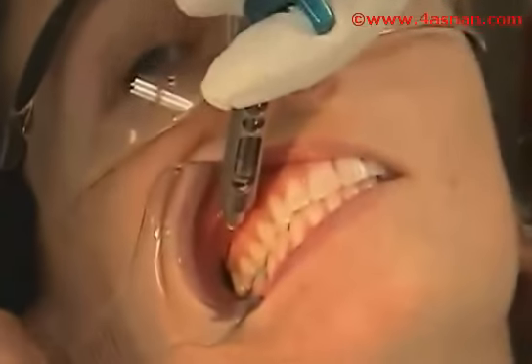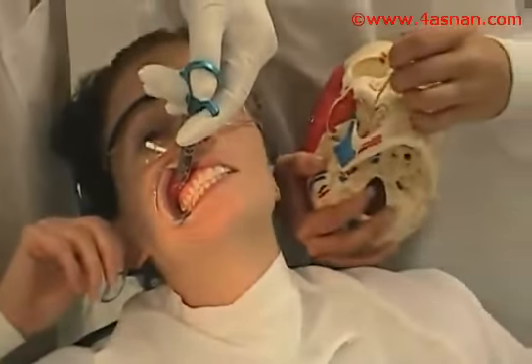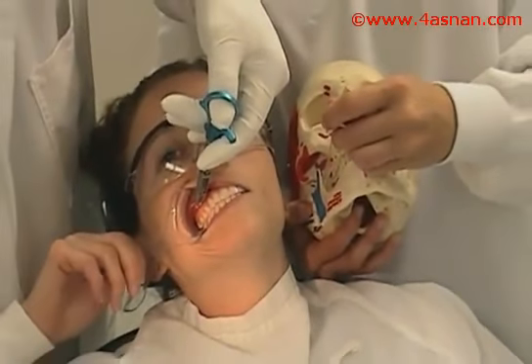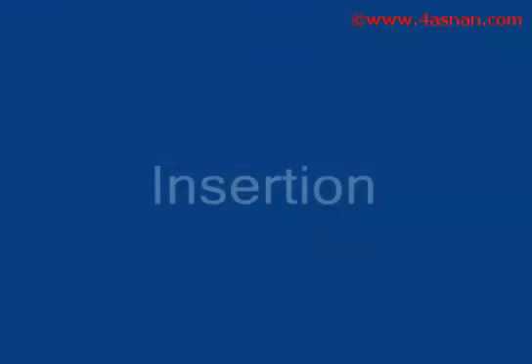Visualize landmarks: the mucogingival junction of the maxillary third or second molar, the maxillary tuberosity. Prepare the tissues as normal by drying with sterile gauze and applying topical as needed.